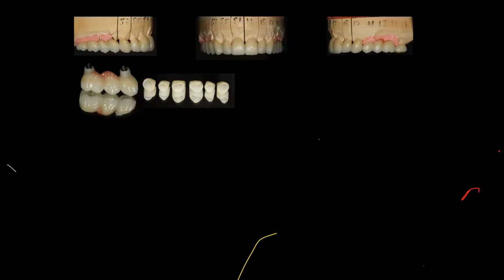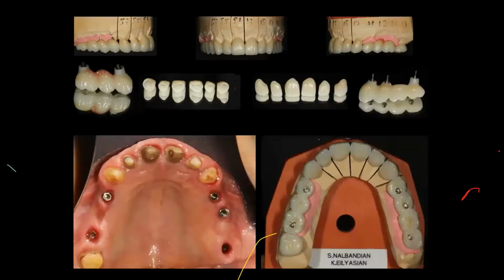But I'll show you later on what happens with a lot of zirconia crowns, because they are very hard. They don't have much of a give. That's a problem I have even with special bruxing patients. And you can see that we lost one of the implants here. That's reversed, unfortunately. The picture's reversed. And implants are planned accordingly to be able to place in the right place. Okay. And here are the zirconia crowns, all adjusted, good canine stops, good posterior contacts for this particular patient.